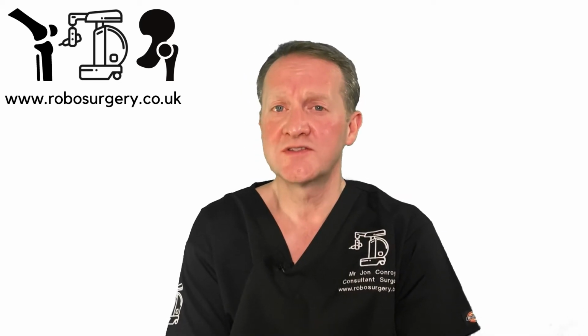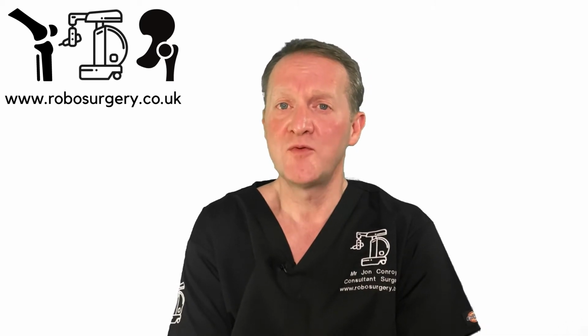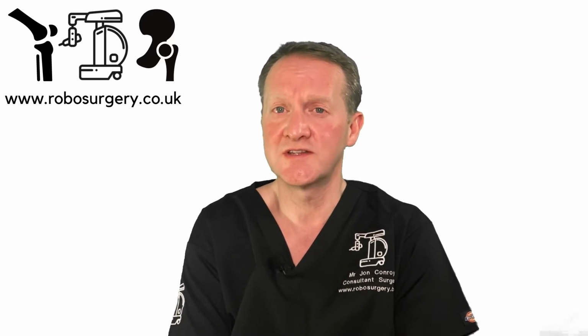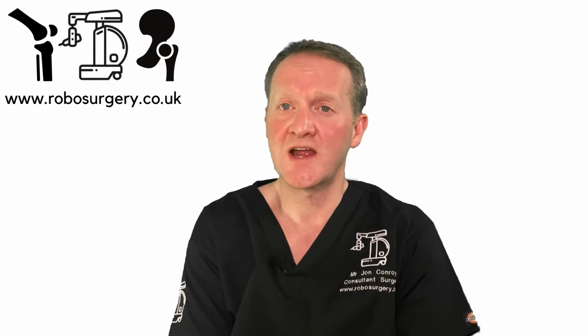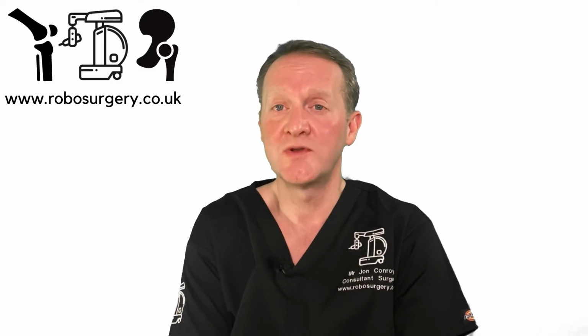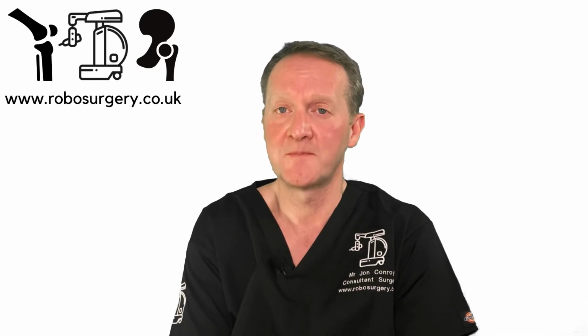Dislocation can be associated with position of the acetabular or socket component of the hip. If we place the socket in the correct position, this is thought to reduce the dislocation risk. Using Mako is the most accurate way of reproducing the position of the acetabular or socket component, and we would expect this to reduce the risk of dislocation in patients.